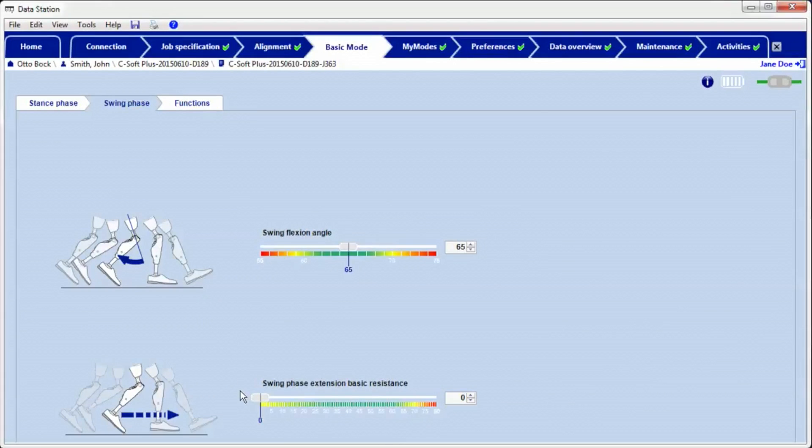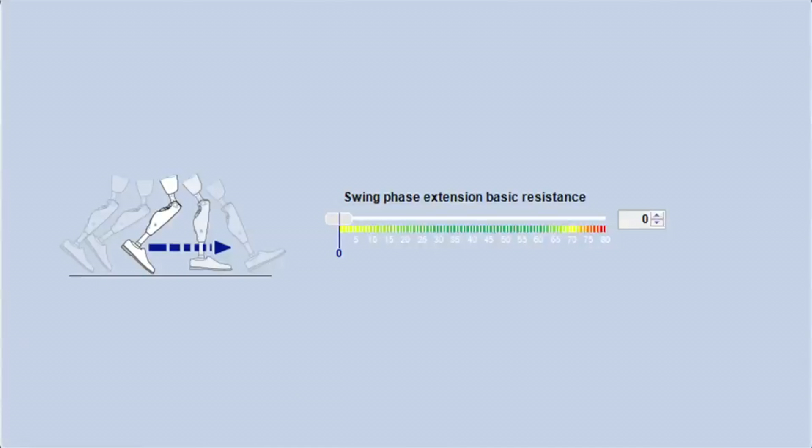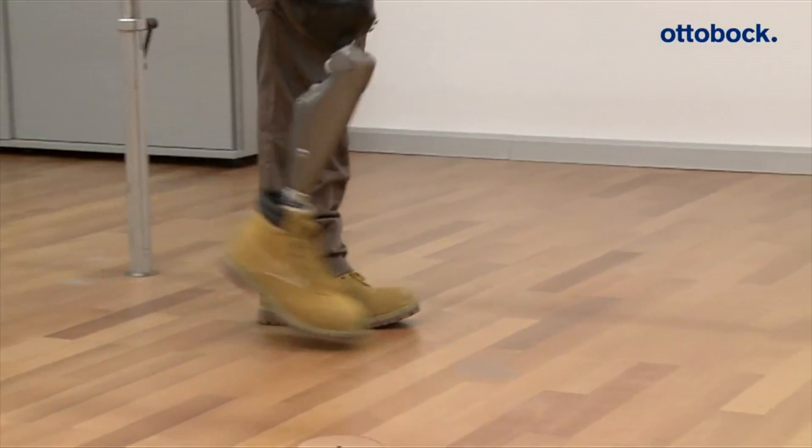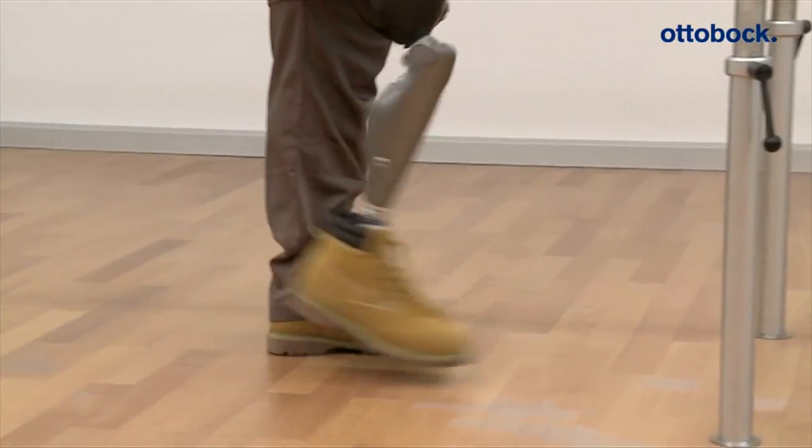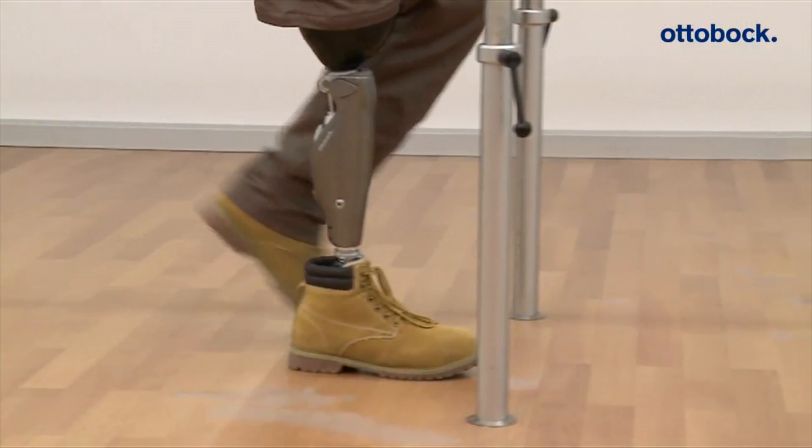If the basic resistance is set significantly too low, the prosthesis swings forward too fast. The patient can get the feeling that the thigh is being pulled forward by the prosthesis. The gait appears asymmetric.